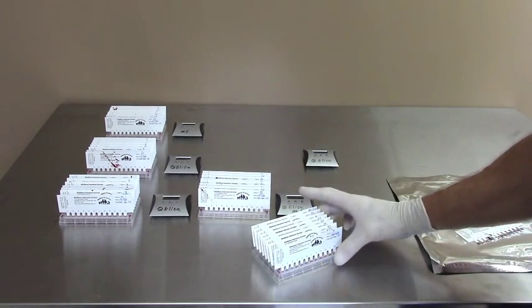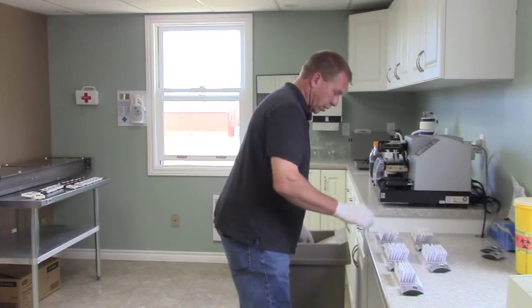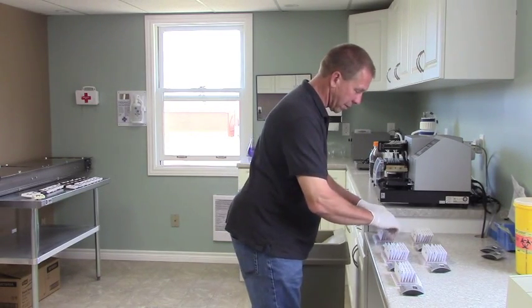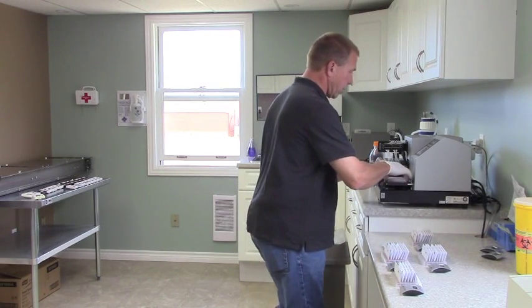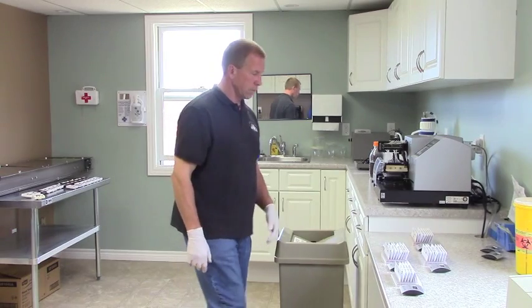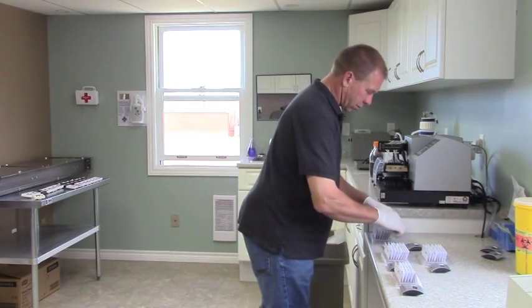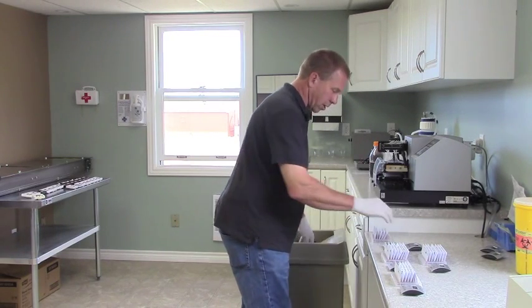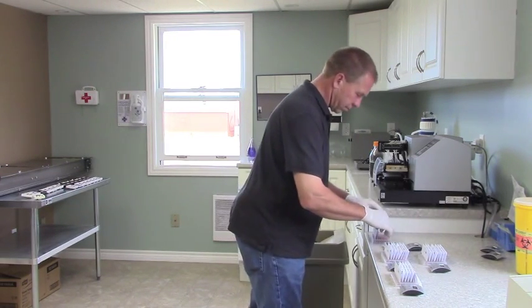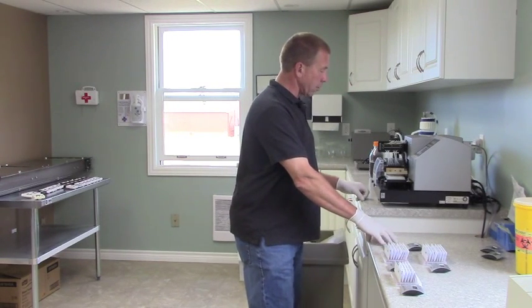The samples sit in a phosphate buffered solution for 30 minutes to incubate and draw the blood out. After the 30 minutes we take the samples out — at this stage the antibodies that we don't know how much the mink have have been released into the solution. Then we wash it all out. There's a conjugate put in there now as part of the chemical reaction.